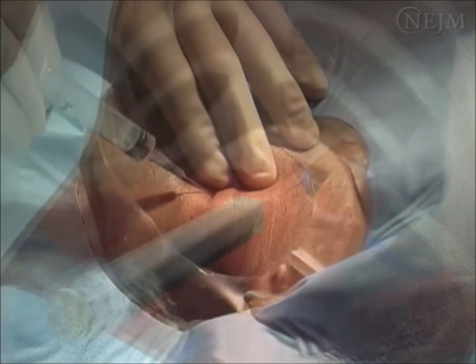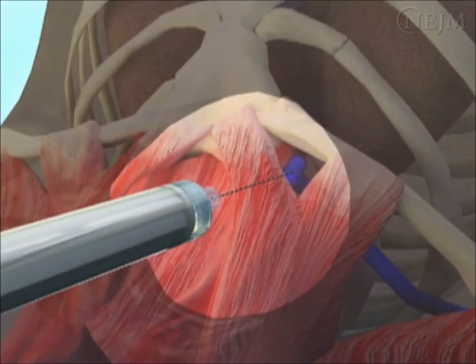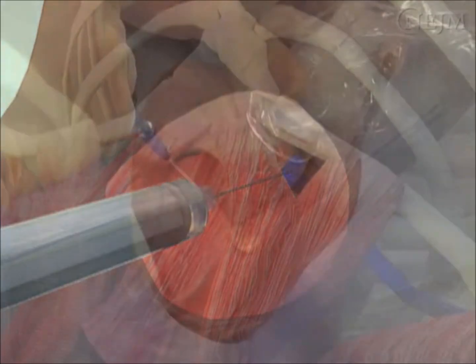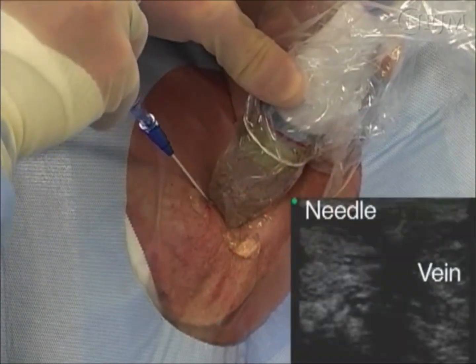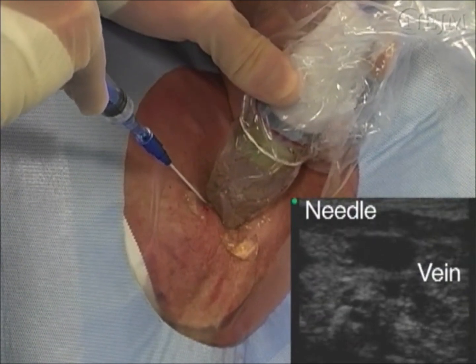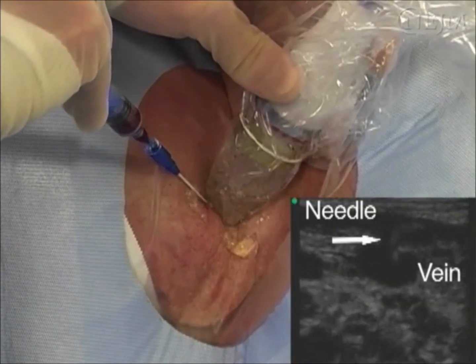Continue to aim toward the ipsilateral nipple at a 45-degree angle to the skin, avoiding penetration into the deep tissues of the neck. Typically, the vein is accessed at a depth of less than 1/2 inch, or 1.3 centimeters. When using ultrasonography, watch for the shadow of the needle to appear on the image. The needle can then be followed into the vessel with ultrasonographic guidance.